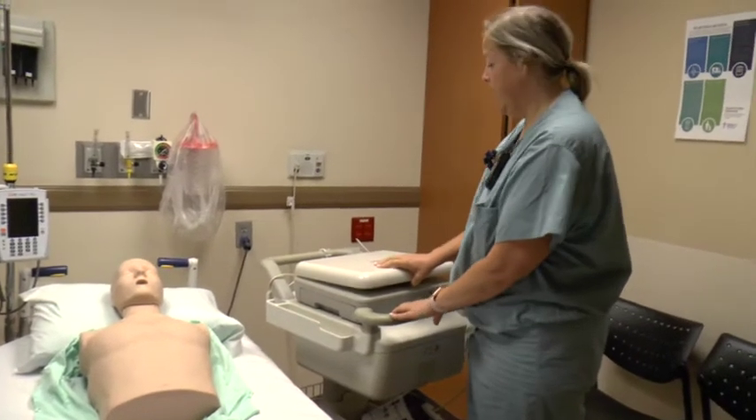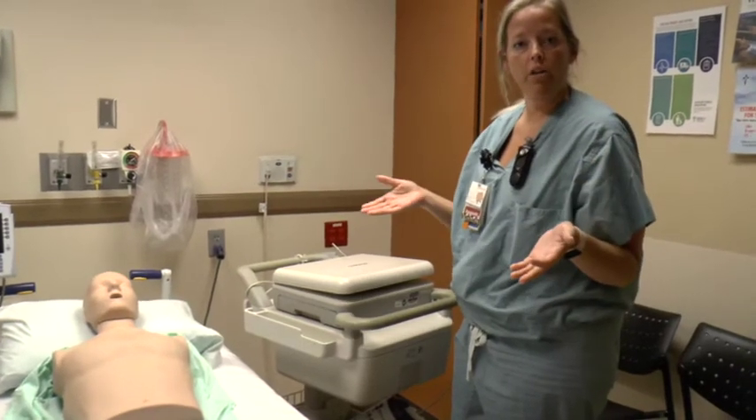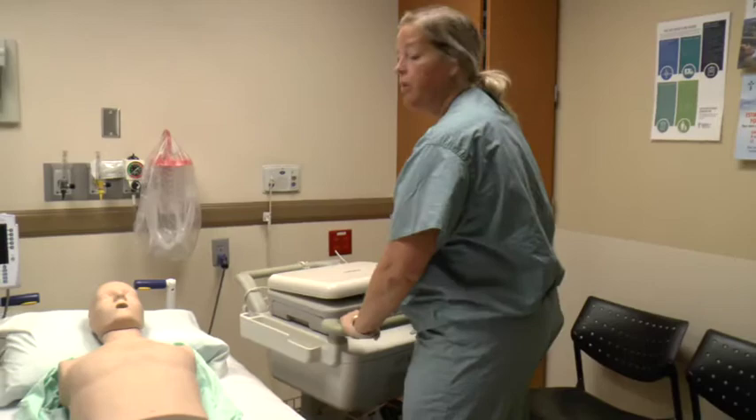Just a quick rundown of how to do EKGs. Our goal from door to EKG is five minutes for chest pain or whenever we need to do one for somebody who has an order.